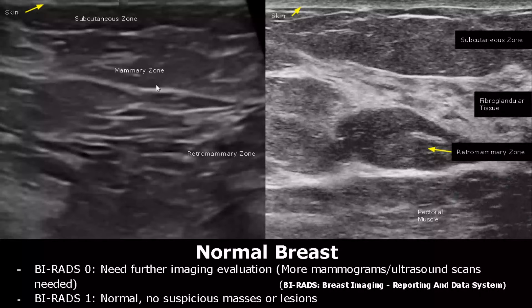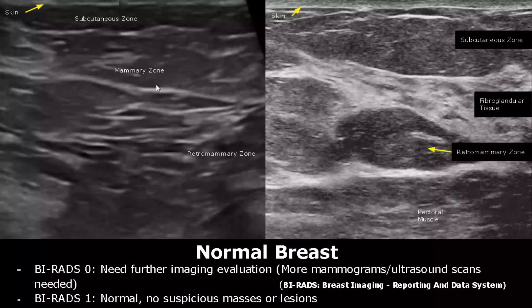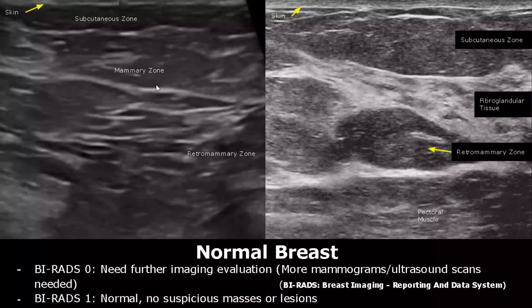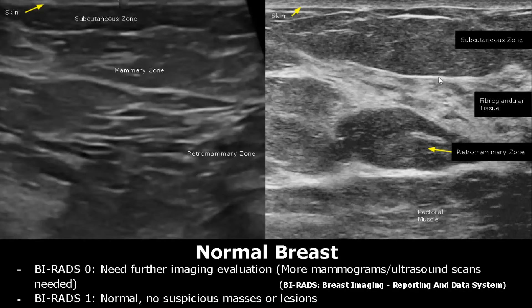Here we have more images of normal breast. We can see the three zones and the fibroglandular tissue, which is hyperechoic. Usually the retromammary zone is below this fibroglandular tissue, but that is not always the case.